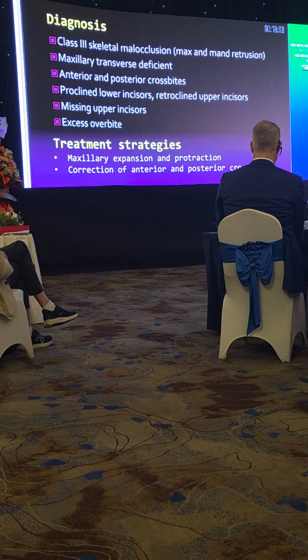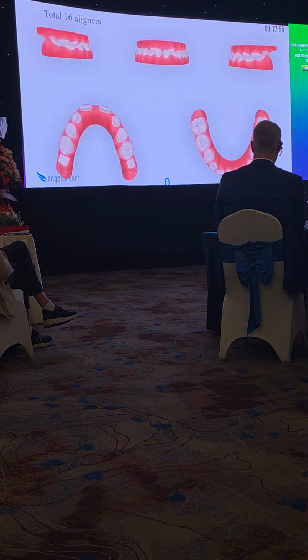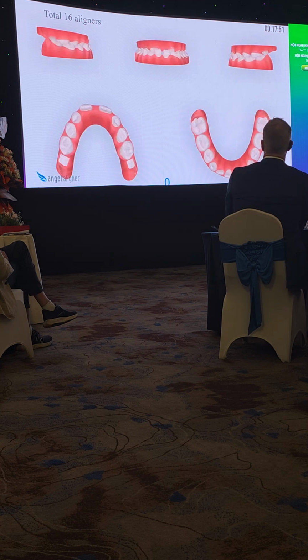So the strategy, I'm going to use the same thing: clear aligners, because the patient doesn't want expansion appliances. It's just that the hygiene is not so good. All right. So we're going to do the same thing now. Watch how much expansion. Okay, the student back there, watch and tell me if the whole one is 6 millimeters.